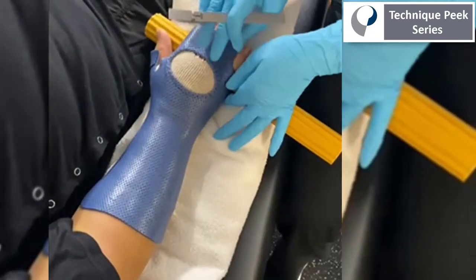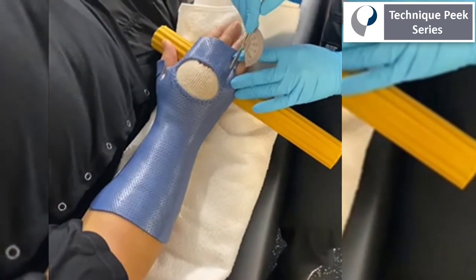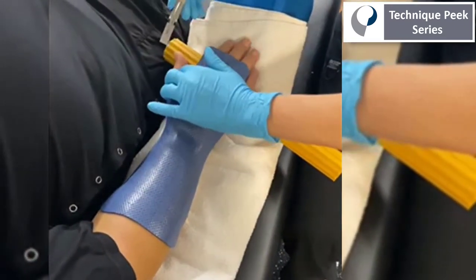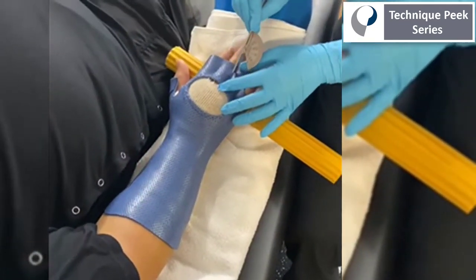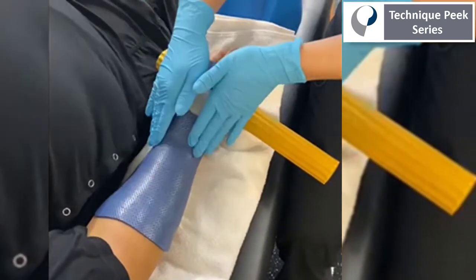Next, I'm going to use a finger goniometer just to provide some differentiation between each digit, which will help us when we add the dynamic component to allow for active digital flexion. It will also pull each finger MCP joint up into this dorsal blocking trough to allow for function of the hand while awaiting radial nerve function.